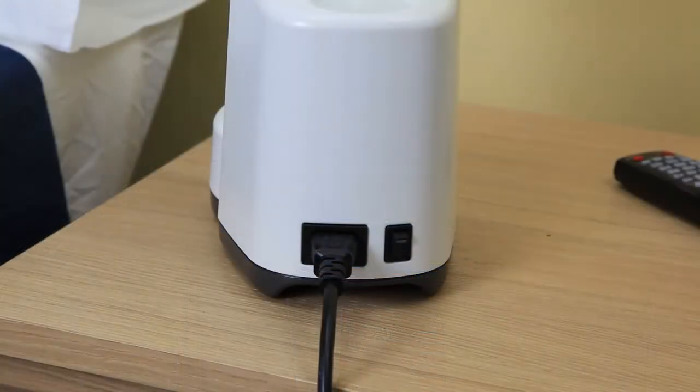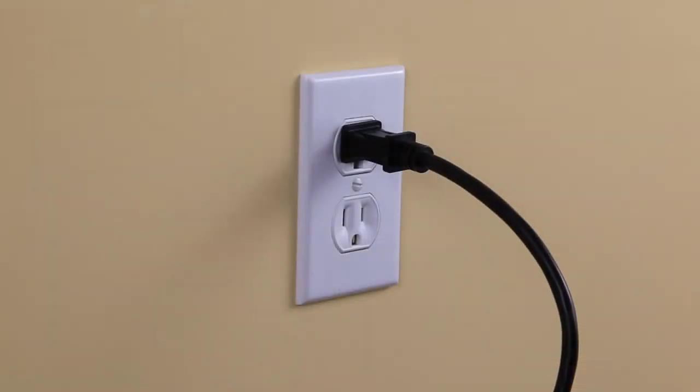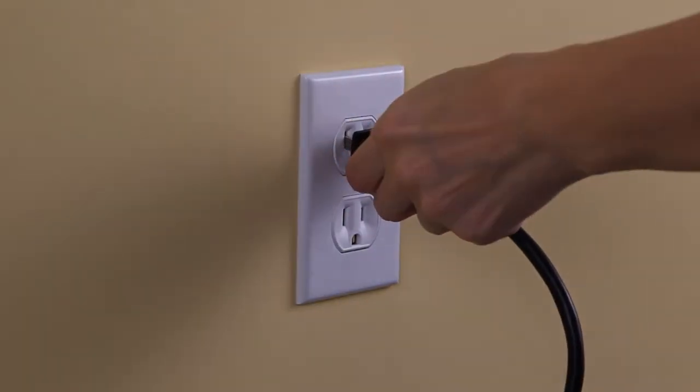Turn the device off by pressing the on-off switch. Disconnect the AC power cord from the power outlet and from the device.